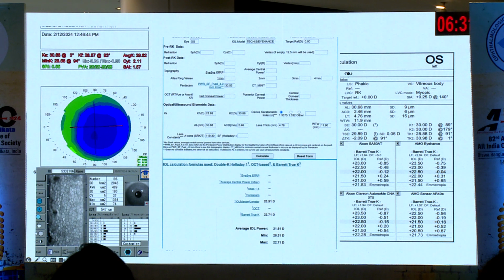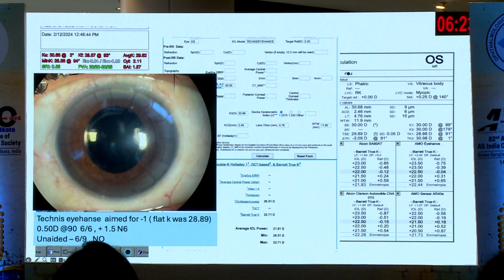It was easier for us to get a value; the ASCRS value was similar to your IOLMaster value also. And we said, okay, we'll go ahead. We actually did a modified or advanced monovision lens, and she's ended up at 6/6 with 0.5 myopia at 1 month post-op, and she's N10 unaided. So we reached what we aimed for, and this was because it was still a reasonably regular topography. Once you have a regular topography, it's a lot easier.